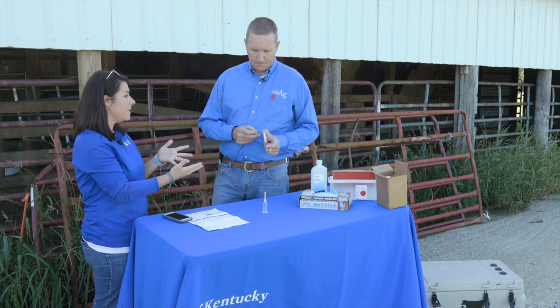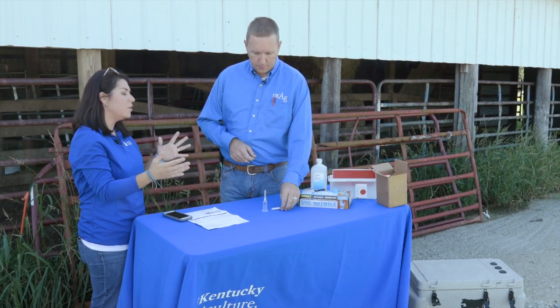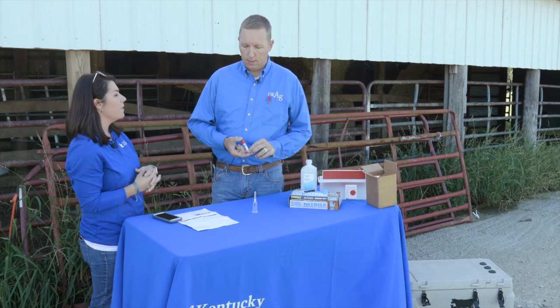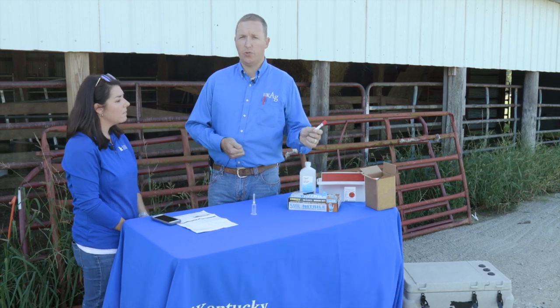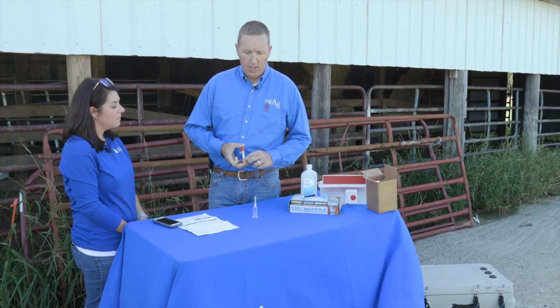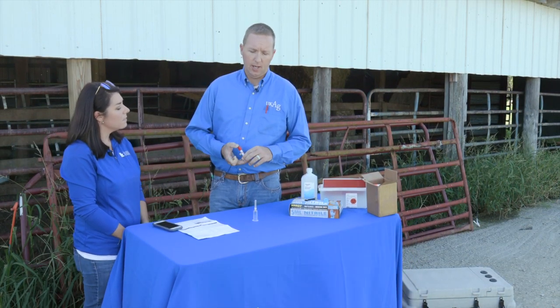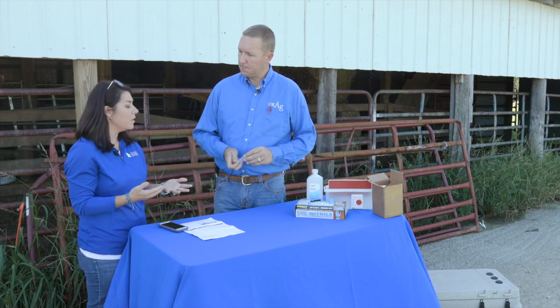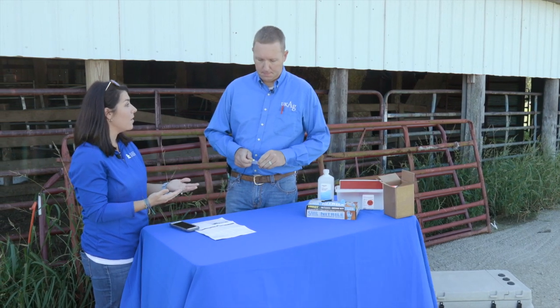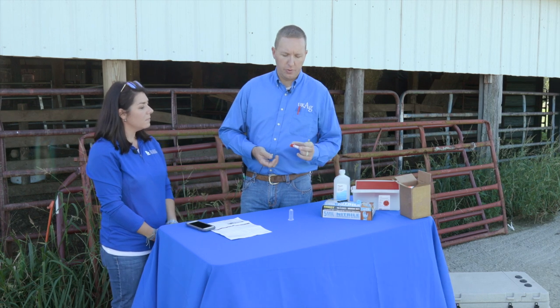This test is called the DG29, where 29 represents the 29th day of pregnancy. At 29 to 30 days on a blood test, that will suffice for a positive pregnancy result. That's important because as a beef cattle producer, knowing whether your cow or heifer is pregnant is an economic decision at that point.